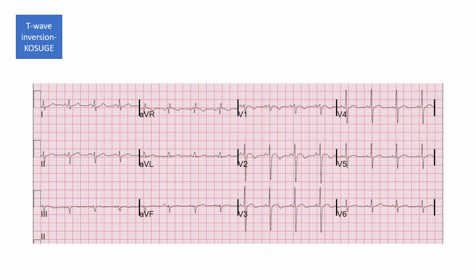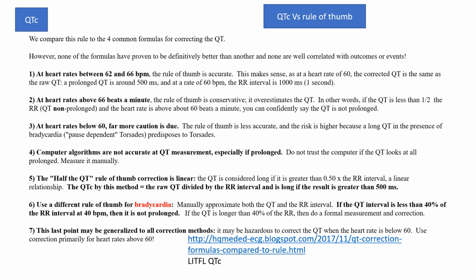That's highly specific for PE. All right, then the QTC, and this is another thing where QTC is quite vaguely defined, right? It really depends on the presentation of the patient and how fast it develops or prolonged, or if they have risk factors such as potassium and magnesium problems, such as medication and so on.